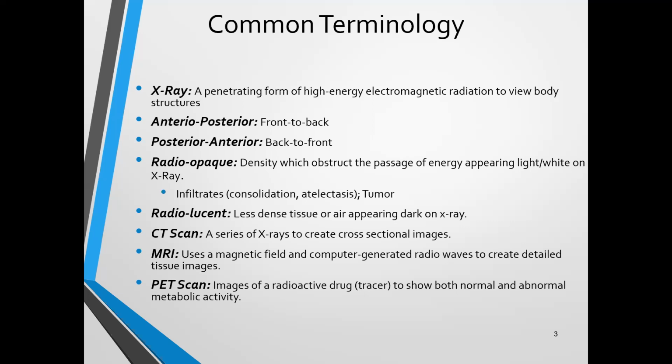So in somewhat simplistic terms, they have a tracer. Many times it's a glucose substance that's also, if you will, tagged with radioactive isotopes. And then on top of that, there's imaging. So you can see areas of enhanced metabolic activity, where that glucose, I'm going to just say, the uptake of it would be much greater. So the PET scan will, quote unquote, light up. And near the end of this presentation, I have a couple of samples that I will gladly share with you.